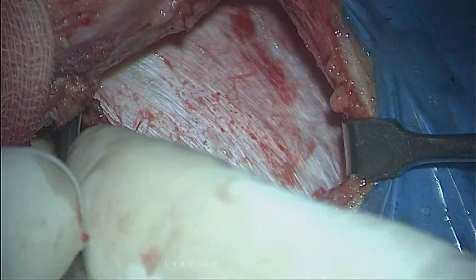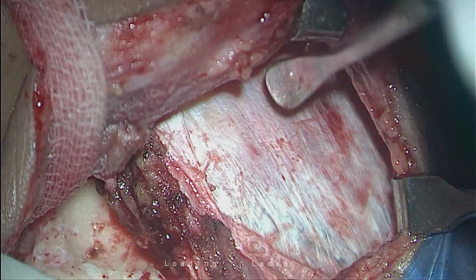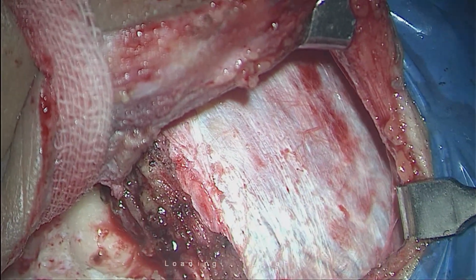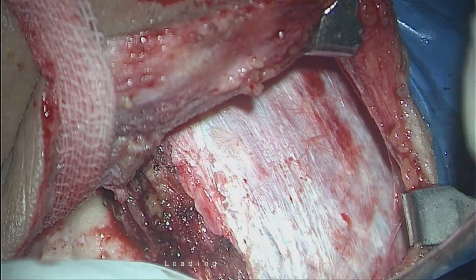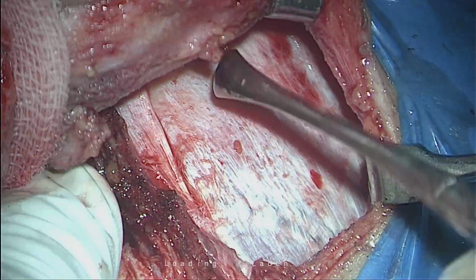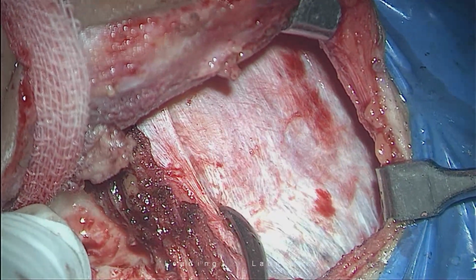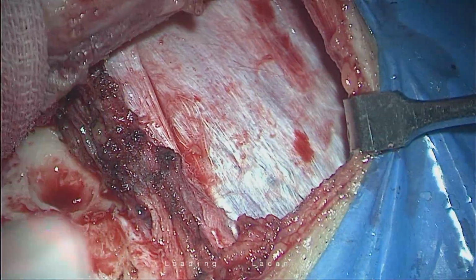Can you see the fascia graft? Yes, sir. See, this is true fascia. This layer which I have separated is the innominate fascia. There are a variety of layers in this region, and this is the innominate fascia which I am separating. See this? And underneath, this is the muscle. Underneath, you can see the vessels of the muscle. Through the graft, you can see.